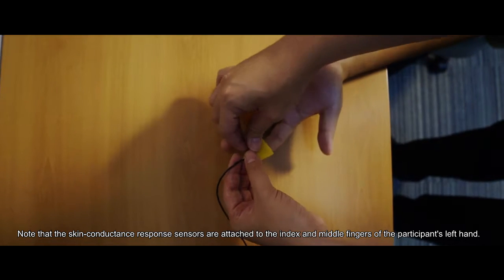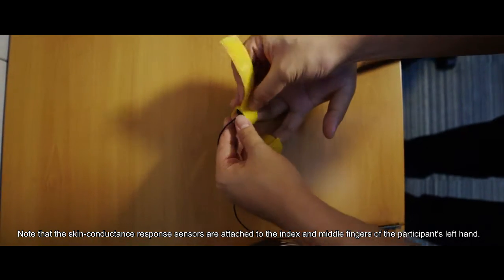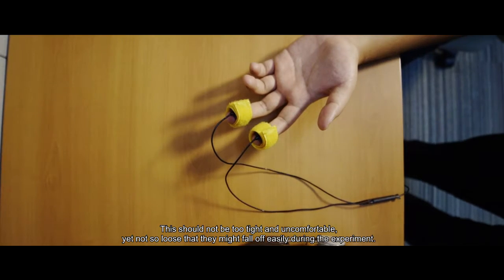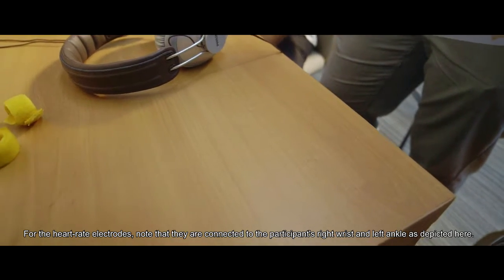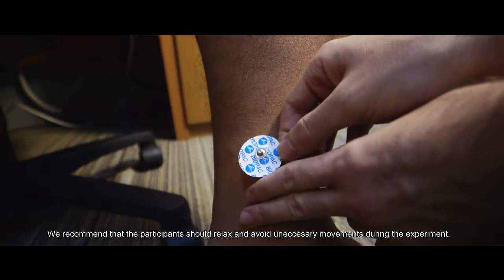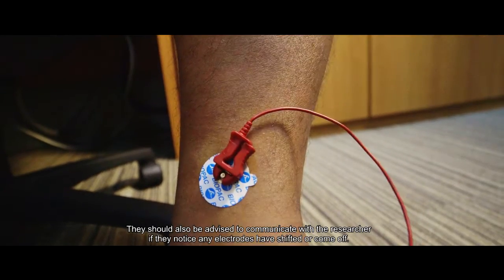Note that the skin conductance response sensors are attached to the index and middle fingers of the participant's left hand. They should not be too tight and uncomfortable, yet not so loose that they might fall off easily during the experiment. For the heart rate electrodes, note that they are connected to the participant's right wrist and left ankle, as depicted here. We recommend that participants should relax and avoid unnecessary movements during the experiment. They should also be advised to communicate with the researcher if they notice any electrodes have shifted or come off.